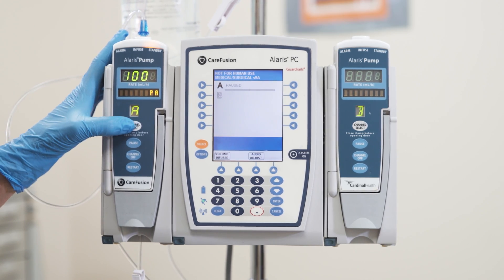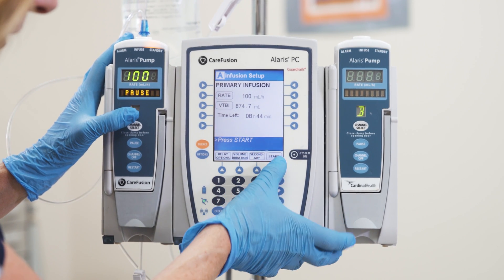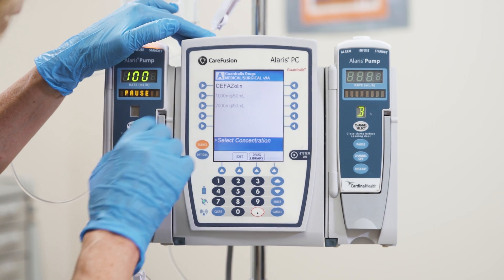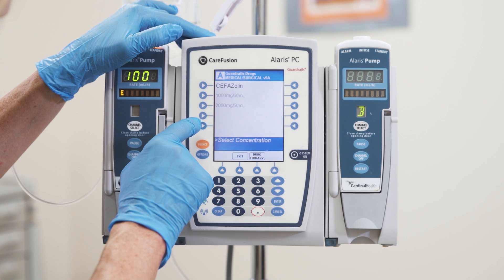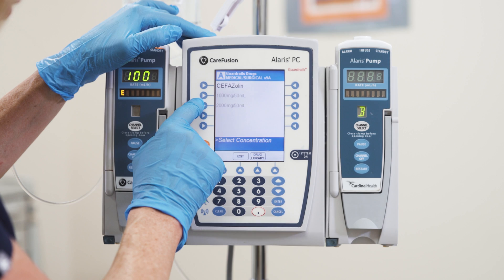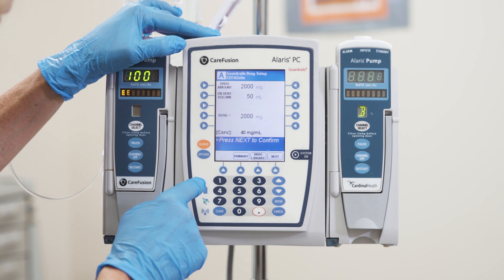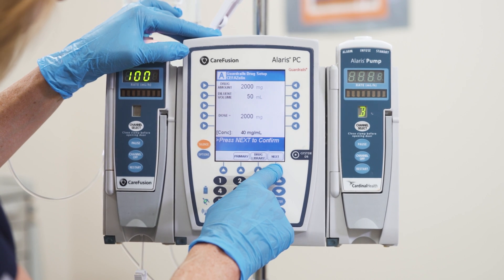My pump is paused and I'm going to push channel select. At the bottom I have a little menu and I'm going to press secondary. At this point I know I'm giving Cefazolin 2 grams, so I will press Cefazolin. It's going to give me an option of 1,000 milligrams or 2,000 milligrams in 50 mLs — I am choosing the 2,000 milligrams, or 2 grams. It's going to ask me to confirm — I'll say yes. Now it gives me another confirmation of the dosage and the amount in milliliters, and I'll press next to confirm.